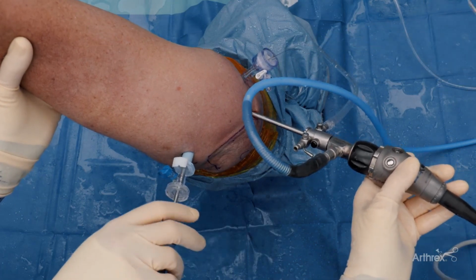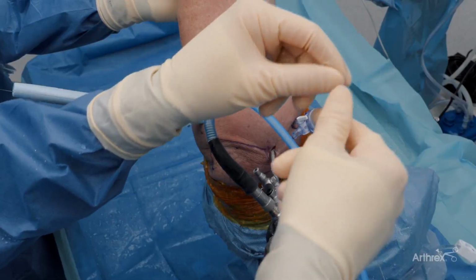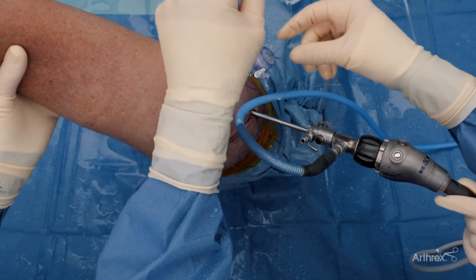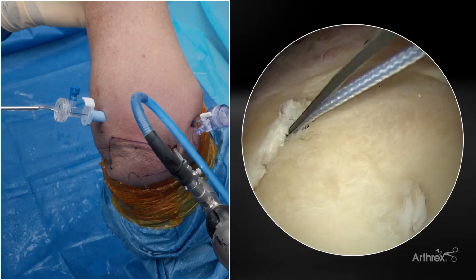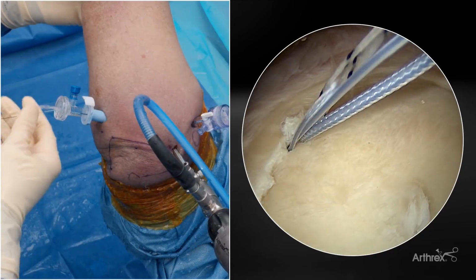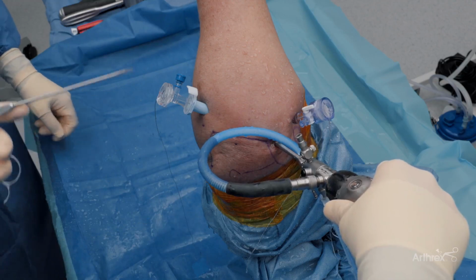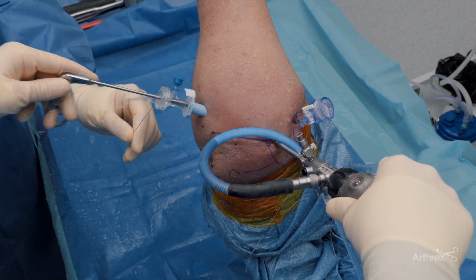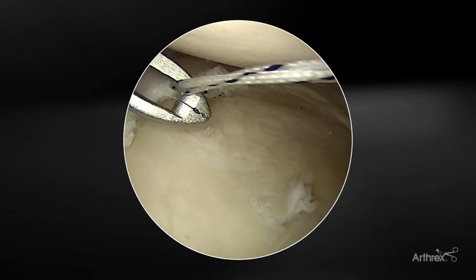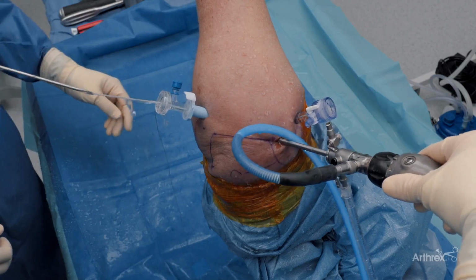And now at this point, we're going to take our working stitch. On this anchor, that's this blue stitch. We're going to pull our working stitch through our loop here. And now as we pull this out, as we're pulling it through, we're going to pull this suture through. As we do this, we're going slow. Now we're going to go back in with a mini kingfisher, and we're now going in through our posterior portal. We're going to retrieve both the suture and the tape here. And you can see how nicely this pulls that tape out. It doesn't cause any abrading there.